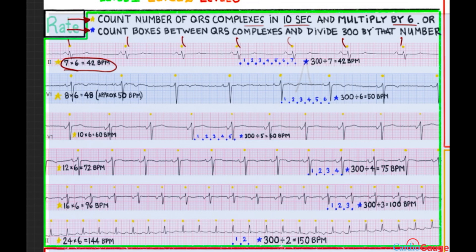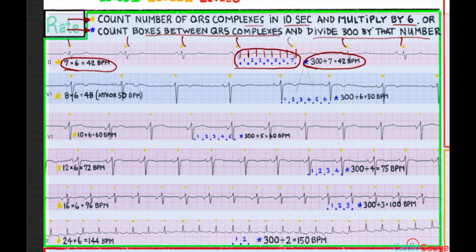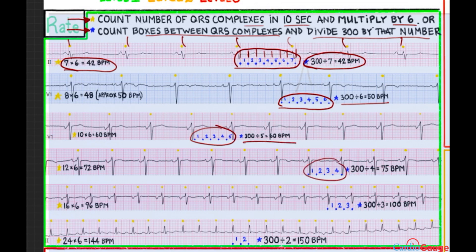The second way is to count the number of boxes between QRS complexes and then divide 300 by that number — the medium-sized boxes. Counting: one, two, three, four, five, six, seven. In this case, 300 divided by seven is about 42 beats per minute. I've memorized these numbers: six boxes is 50 bpm, five boxes is 60 bpm, four boxes is 75, three boxes is 100, two boxes is 150. Generally when I do the rate, I use this second method because it's faster.